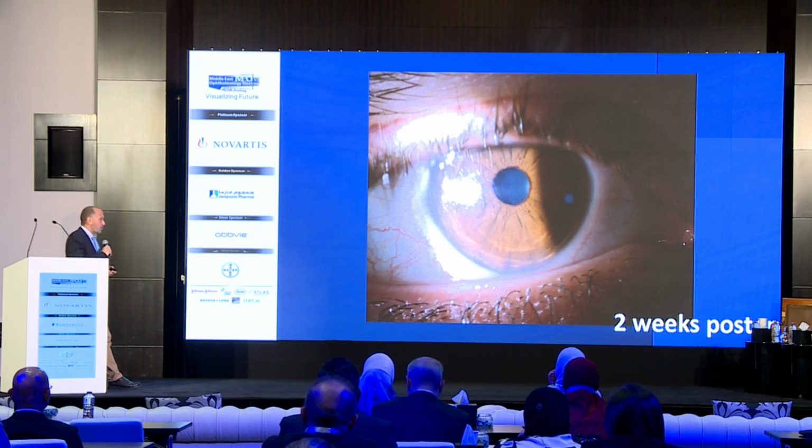Yes. The problem, Ashraf, was manifold. The first thing is that this is a patient that we will amputate the flap in, so you'll end up with a really thin cornea. Not really thin cornea, but we're talking about 300s. So I wouldn't prefer doing any PTK more than this. Number two, if you're going to do a PTK, you will need to have a coupling agent that has the same ablation threshold as the corneal stroma. And we do have this, and we can actually use the epithelium itself that's in the gutter as a coupling agent. But I didn't want to be over-philosophical in this type of patient, and I wanted to do something which is straightforward and really appraise the results.